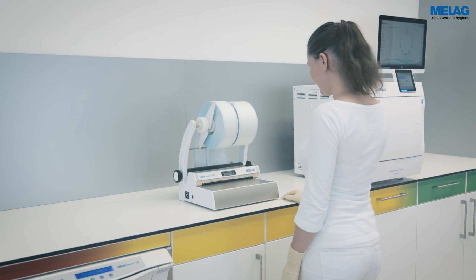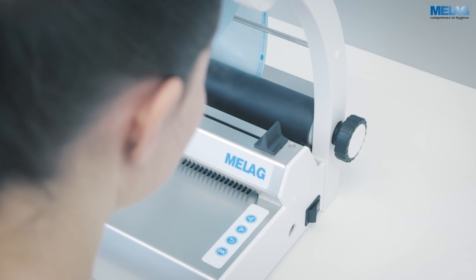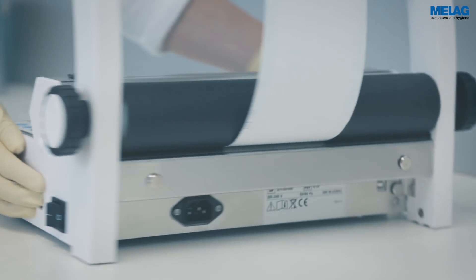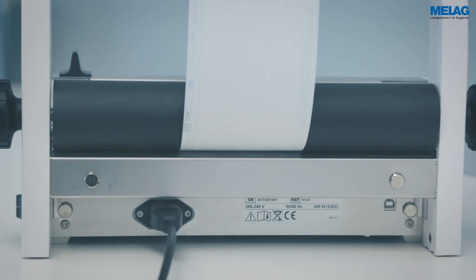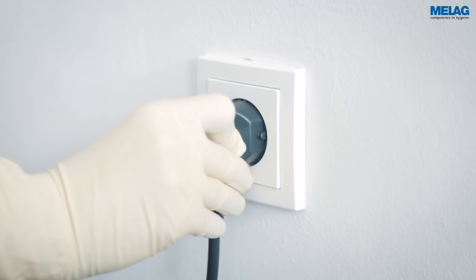The power switch on the right-hand side of the device should be switched off before initial commissioning. Connect the sealing device to a socket using the power cable. Please ensure that the electrical connection complies with the specifications in the user manual.